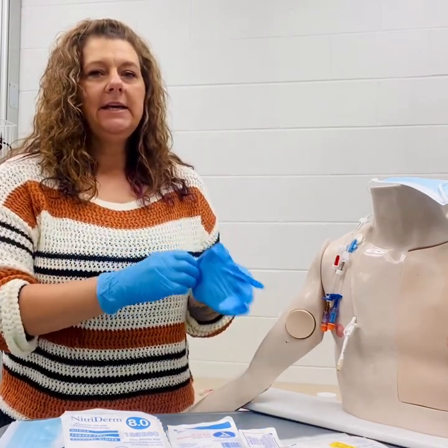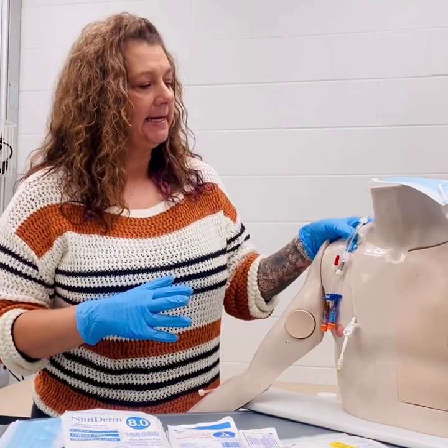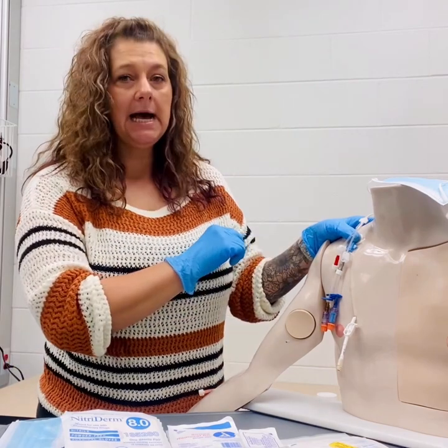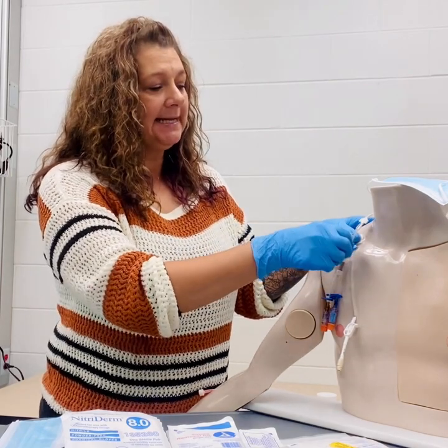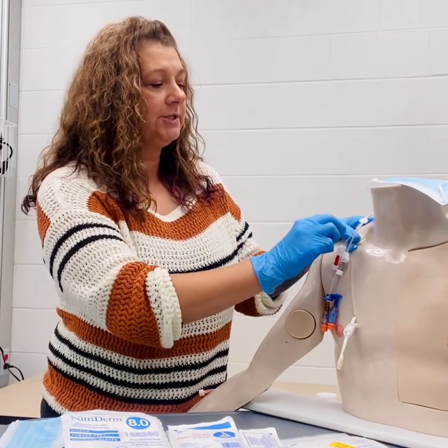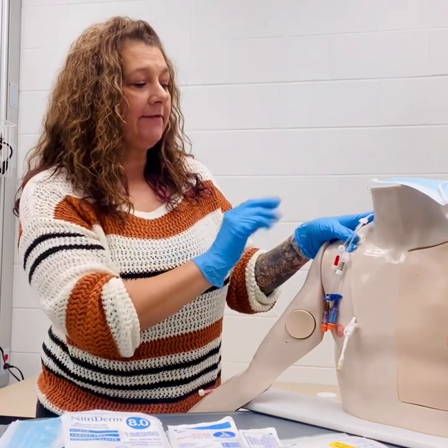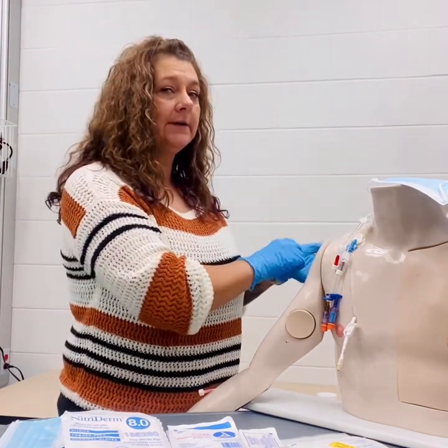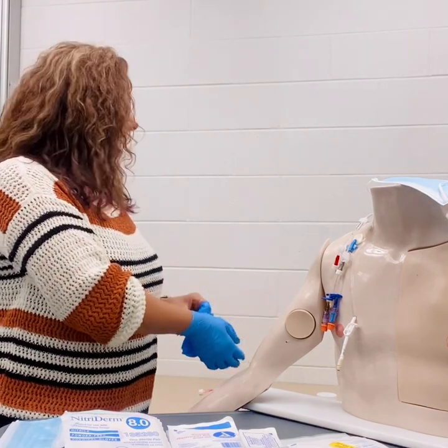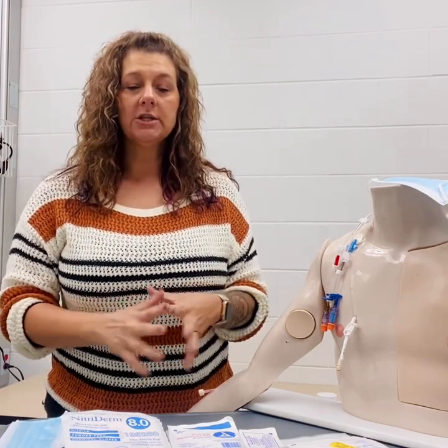When removing the old dressing from a central line, we want to take our non-dominant hand and place it over the insertion site just to ensure that we don't pull anything loose while we're removing that dressing. You'll peel that dressing inward towards the insertion site from all four corners, and then pull that dressing off completely. Then we can remove our gloves and again perform hand hygiene and dry our hands.